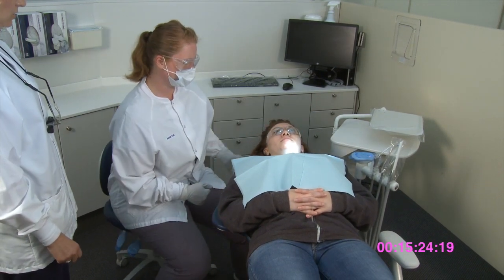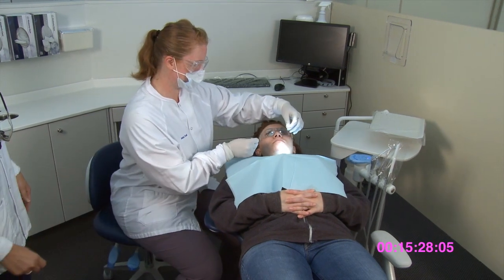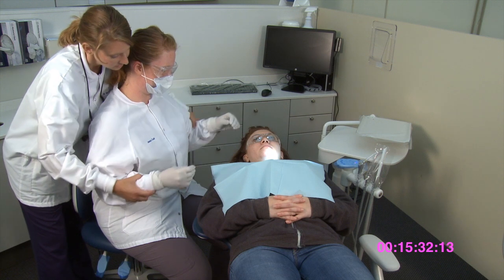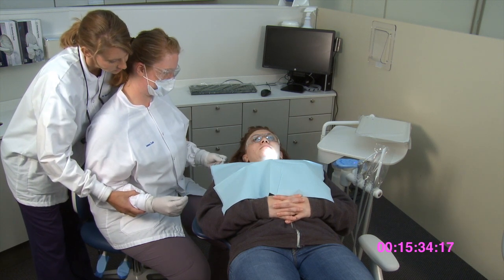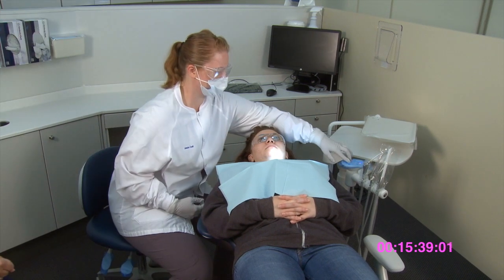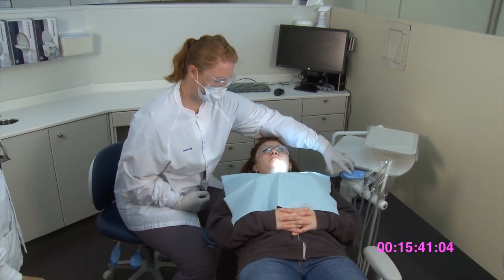The patient here is too high, as the clinician's shoulders and arms are not in a neutral position. You want to avoid having an angle between your upper arms and forearms of less than 60 degrees. She will need to lower the patient so that her head is closer to the clinician's navel.